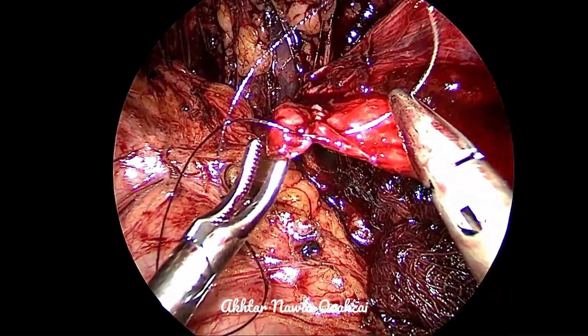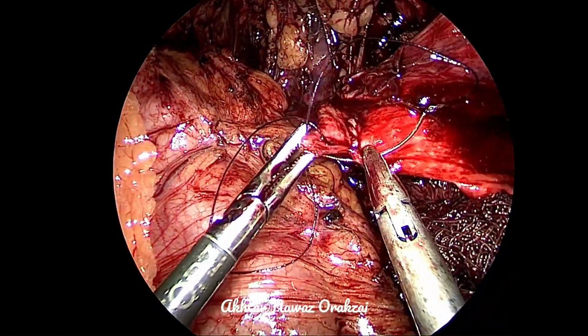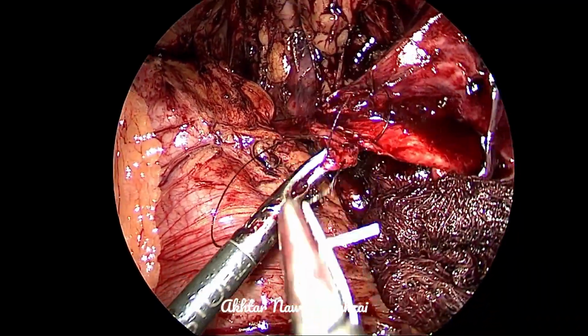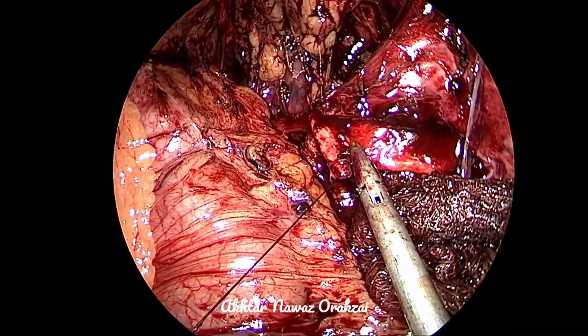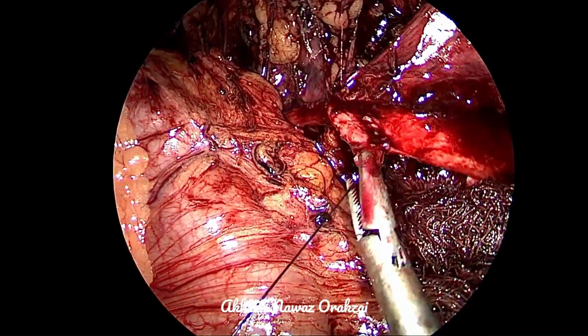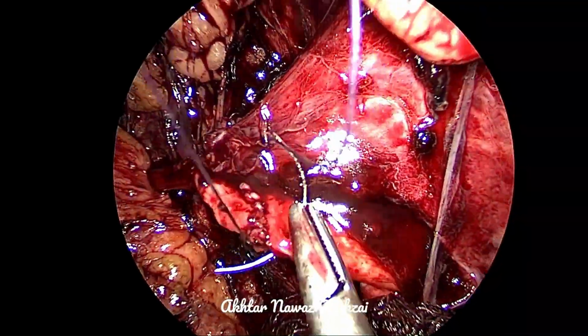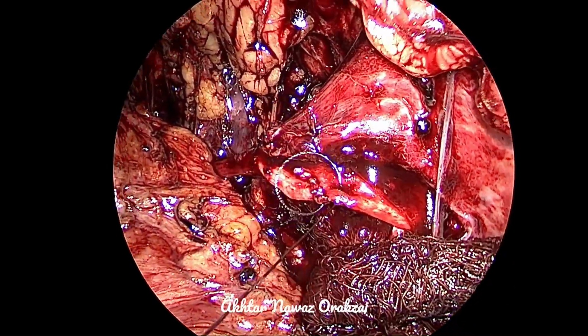In this case, if you have resected a lot of pelvis, especially the margin of the pelvis along the lower border of the kidney, lower pole of the kidney, then it's difficult to approximate the ureter and the pelvis, so that will lead to tension on the anastomosis.